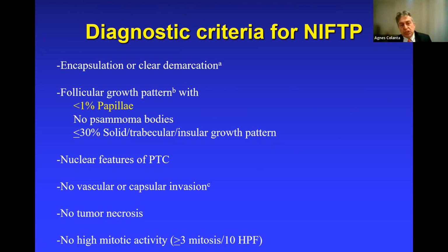And then there is a specific point of contention here, which is the number of papillae. What happens in papillary carcinomas, I'll show you, is the more papillae you have in a lesion, the higher the chance of lymph node metastasis. But we showed that we can accept less than 1% papillae.